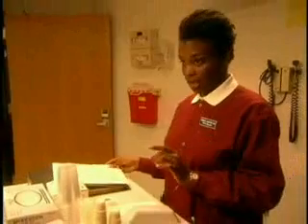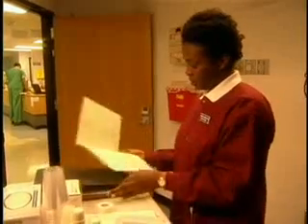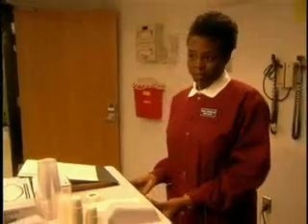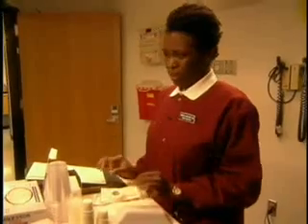First, I check the medication order against the original order. Check for allergies and any inconsistencies. Observing the 3 checks and 5 rights. Then gather my equipment. Okay. The MAR, the mini pump infusion tubing, alcohol swabs, and tape. The syringe pump is in his room, right? Keep going. You're doing fine.